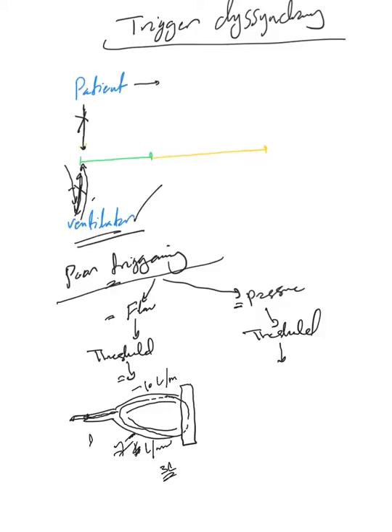The same thing here, you put a threshold for the proximal airway pressure, PAP, which is the pressure that's sensed right here at the ventilator circuit. When we try to breathe, please go back and see my videos on pressure trigger, we drop the pressure in our chest, which gets transmitted and sensed by the ventilator.